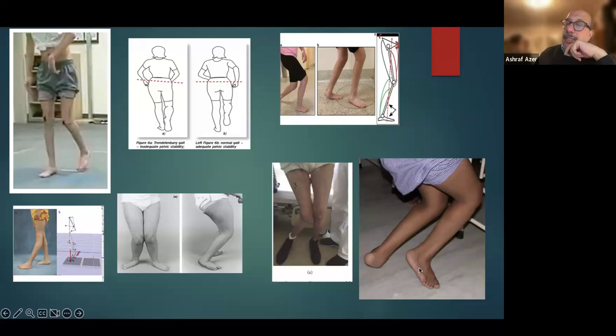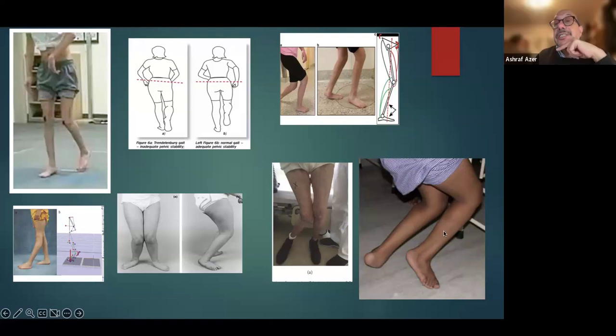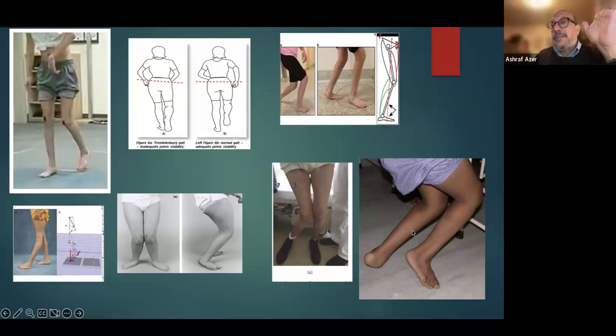A custom-made orthotic device. Why? Because there is no off-the-shelf orthotic which can usually accommodate this type of spasticity. Can he walk after that? Most likely crouching again, but it will be less painful. Can a ground reaction orthosis improve his condition? A little bit. And it has to be followed up all the time with stretches, possibly surgery. But if you do Achilles tendon only, because some orthopedic surgeons will do Achilles tendon only here, then you weaken this muscle and end up with the patient sitting in a wheelchair.